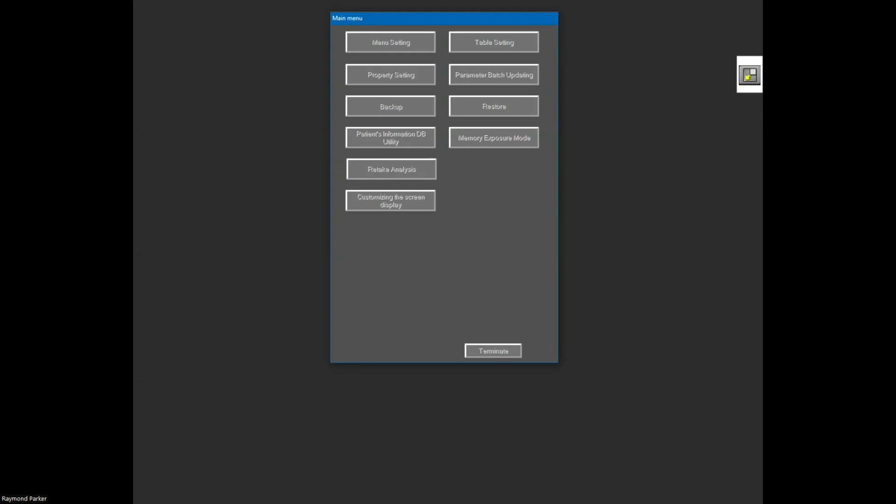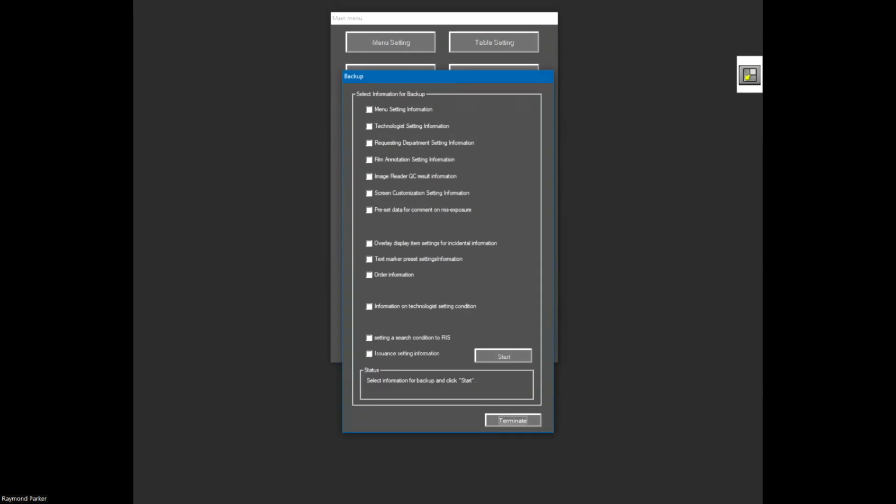So to do that, you would select backup, and the one that you're going to pick or activate, if that was all you're moving, we would not cross platforms with anything else. But if you just wanted to move your username and password for those 50 technologists, back up, make sure when you name this folder, and you can see the backup process in one of the other videos, but make sure you put a naming convention on that just so you alert someone that you've only pulled the technologist information on that backup.